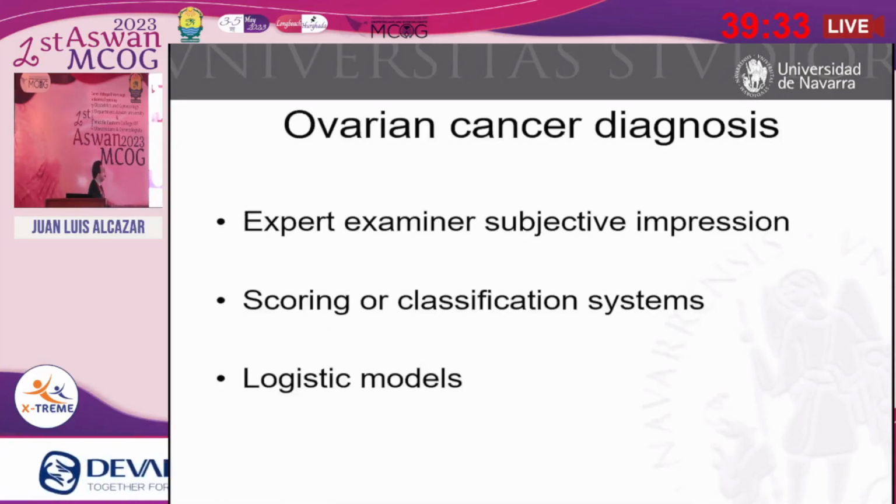So regarding ovarian cancer diagnosis, probably all of you would agree that ultrasound is the best imaging technique for diagnosing ovarian cancer. The ovaries are not easily reachable to take a biopsy, contrary to the endometrium or to the cervix or vagina or vulva. So we have to invade the body of the lady to take a biopsy. And this many times is complicated. It's a really invasive procedure. And so we have to rely on imaging techniques. And ultrasound is the best one.